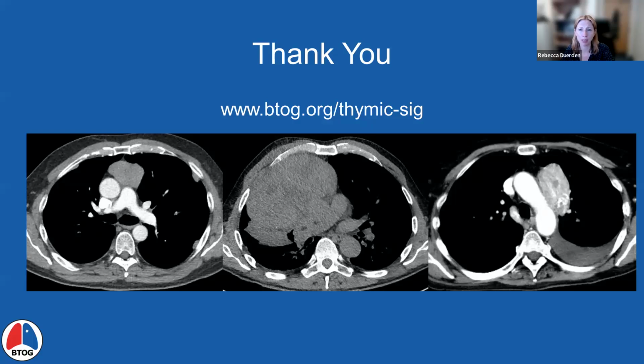But I think there isn't a lot of support for radiologists with regard to making that call when the quality of the imaging is slightly suboptimal, should we say. So for example, there's some cardiac motion artifact. For example, the patient's breathless on a CTPA, and you asked, what is this lesion that's sitting there? Is it a lymph node?